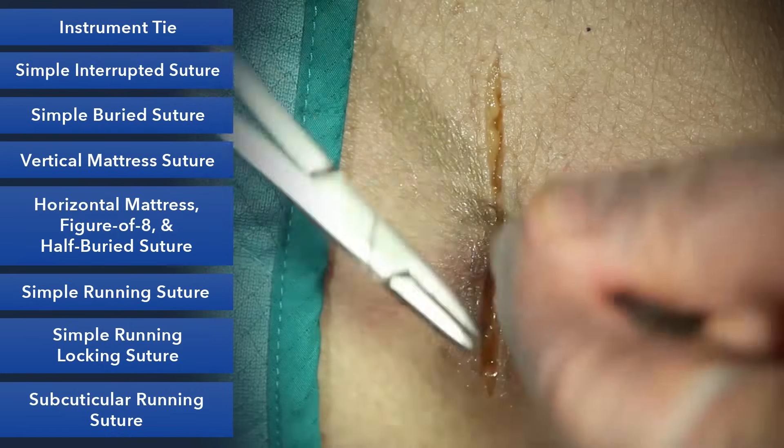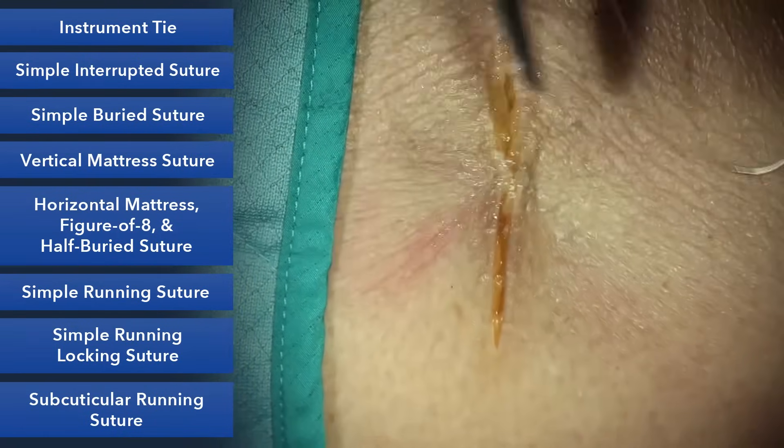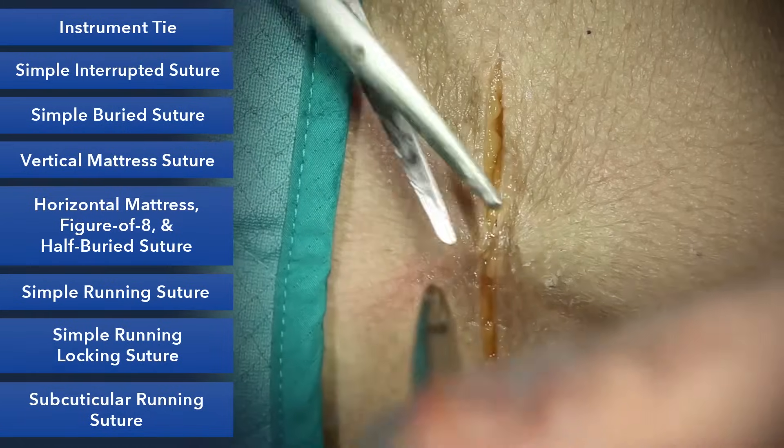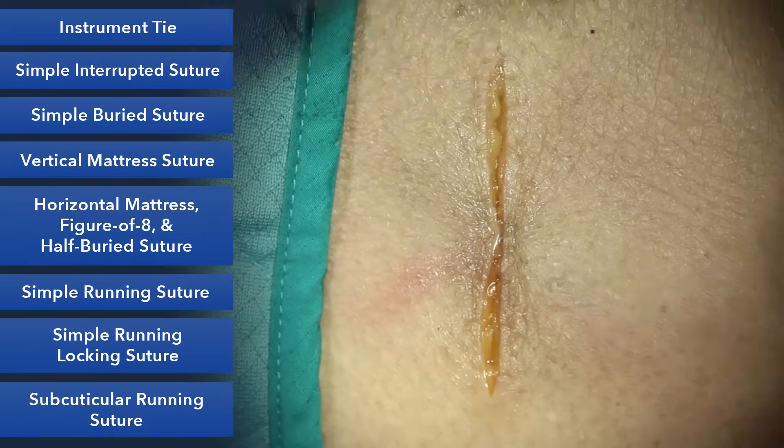We'll do a nice instrument tie. What this does is take the tension off the skin so that when you go to do your skin closure, you can really focus on approximation. You can see here that it helps hold everything together.